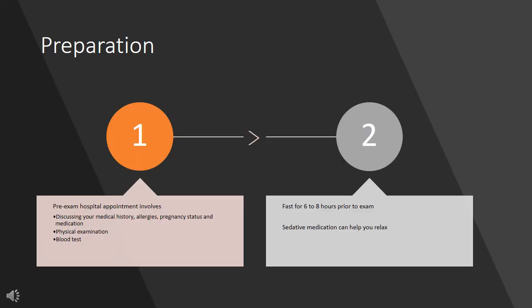Preparation for the procedure. You may have a pre-exam hospital appointment to check that you can have the test. Before the exam, you will be told if you need to stop taking any medication. Speak to your doctor if you would like to have a sedative medication to help you relax for the exam.